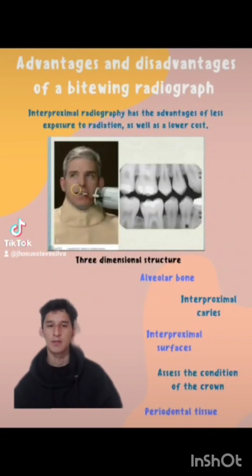I will now explain the advantages and disadvantages of a bitewing X-ray. To begin with, we must note that this radiograph has the advantage of less exposure to radiation. It is also useful to have an image of the structure being observed.